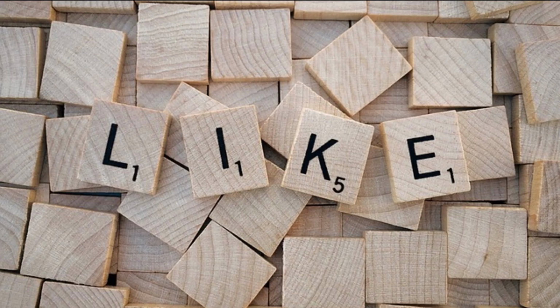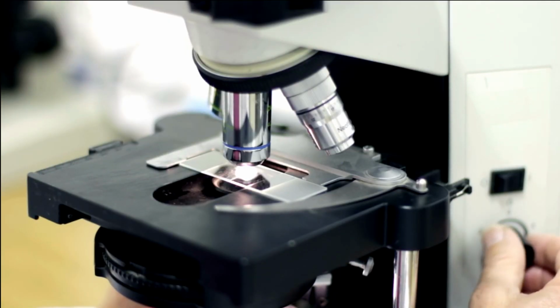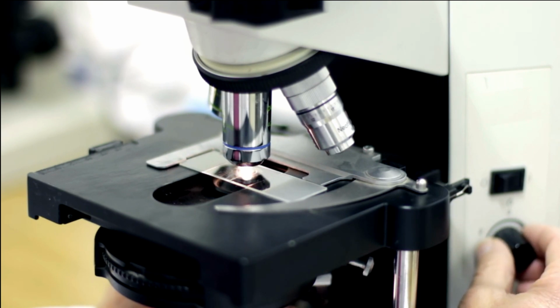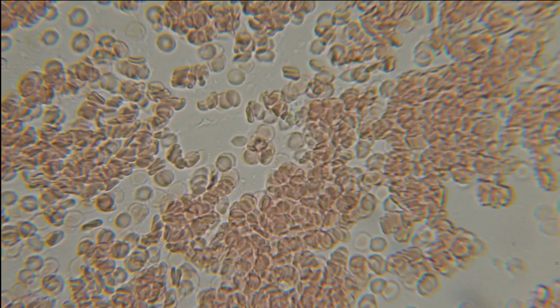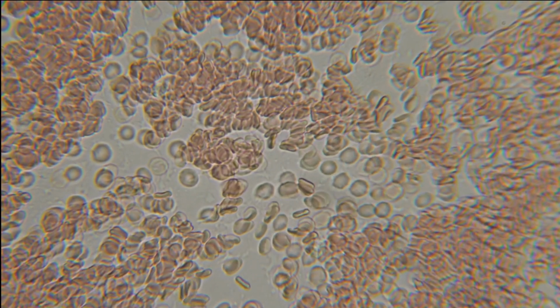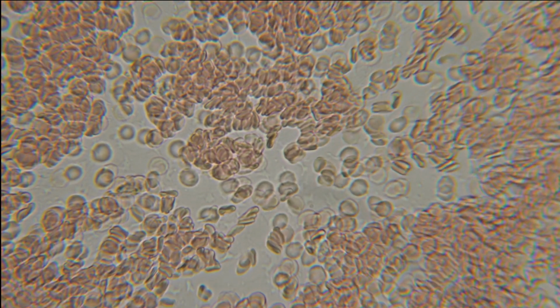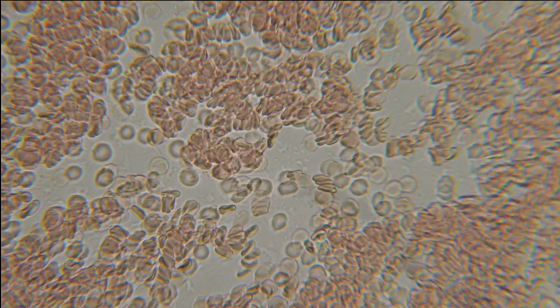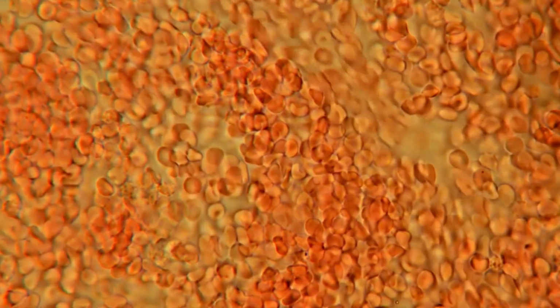Next, the microscopic examination of urine reveals cellular and structural components, providing invaluable insights into a patient's health. Let's start with red blood cells, or RBCs. Increased RBCs in the urine could indicate a variety of kidney disorders, a bladder disorder, a urinary tract infection, or be from the menstrual cycle. A chemical on the urine dipstick pad will change colors, and this color change will indicate the semi-quantitative amount of RBCs in the urine.